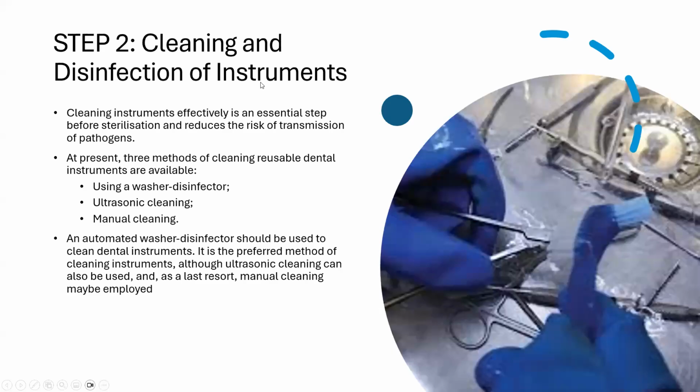Cleaning and disinfection of instruments, that is step 2. Cleaning instruments effectively is an essential step before sterilization and reduces the risk of transmission of pathogens. At present, 3 methods of cleaning reusable dental instruments are available: using a washer disinfector, ultrasonic cleaning, and manual cleaning.